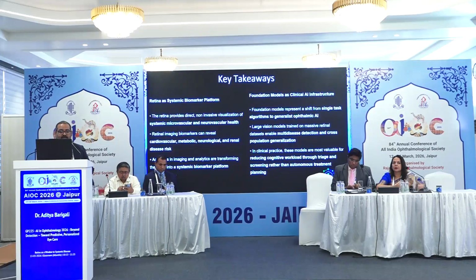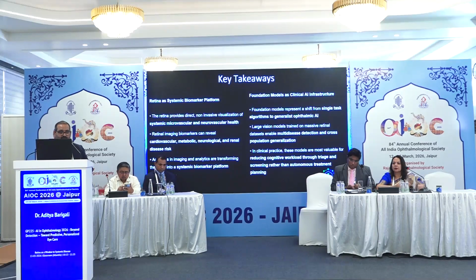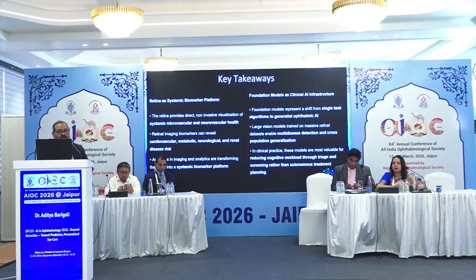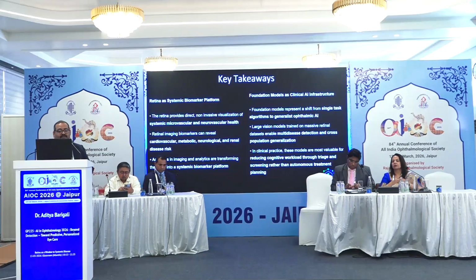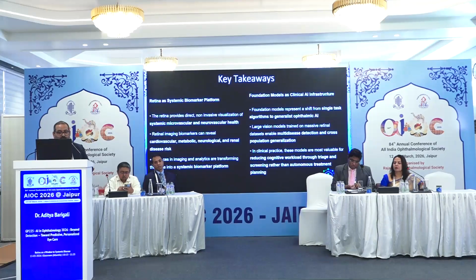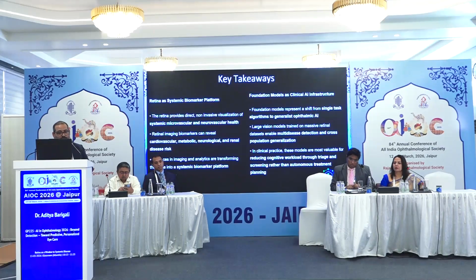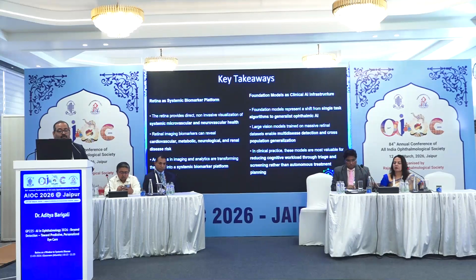Foundational models as clinical AI infrastructure represent a shift from single-task algorithms to generalist ophthalmic AI. Large vision models trained on massive retinal data sets can provide multi-disease detection and cross-population generalization. Currently in clinical practice, they will be most valuable for reducing our workload through triage and screening rather than autonomous treatment planning.